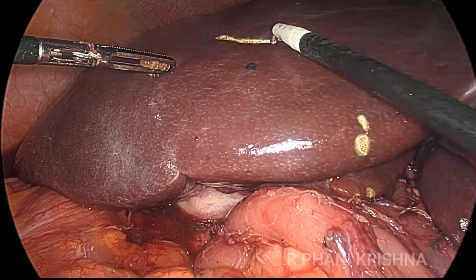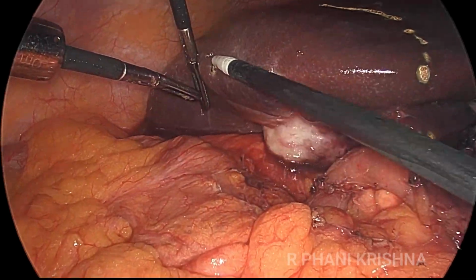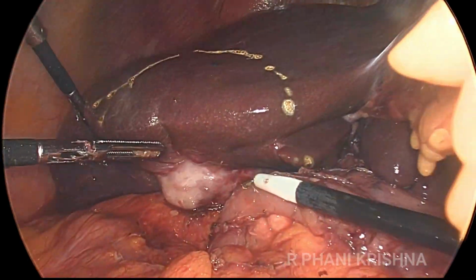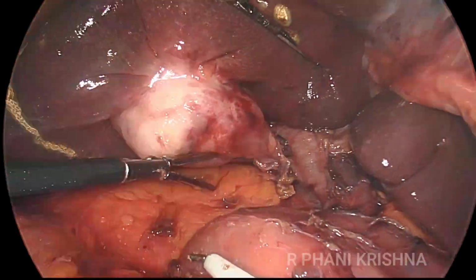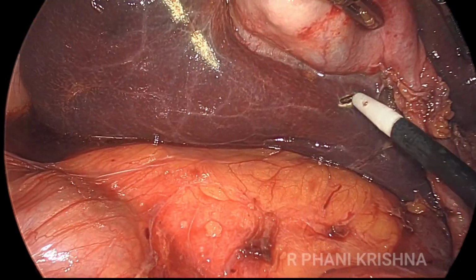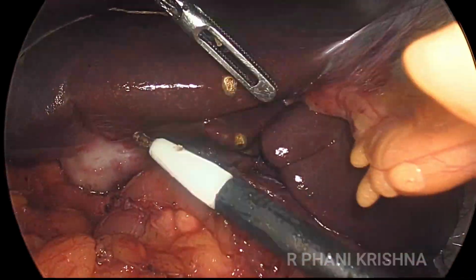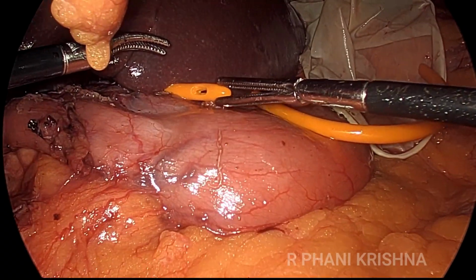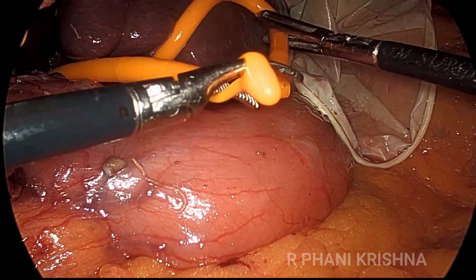In this patient, we planned for a 3 cm wedge of liver. The wedge is marked all around. The most important thing in this wedge is that as you go down, you have to taper it down. It's like a reverse pyramid, and it tapers down towards the neck of the gallbladder. You don't take the wedge all the way till the hilum, because the portal pedicles will come there. The marking you've seen here.